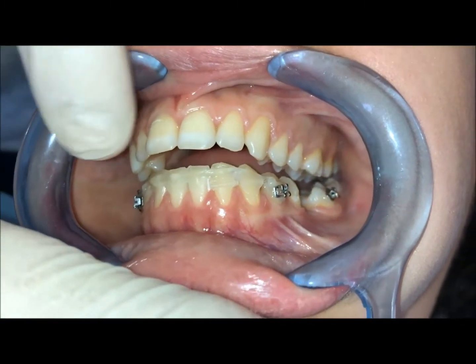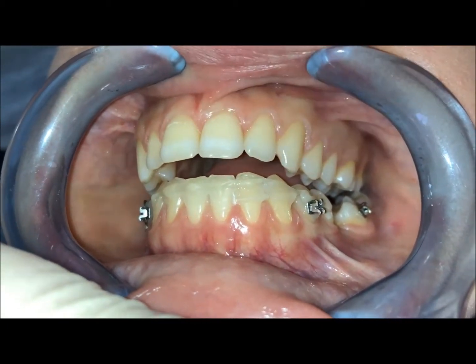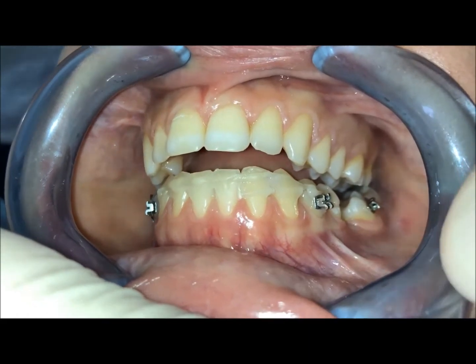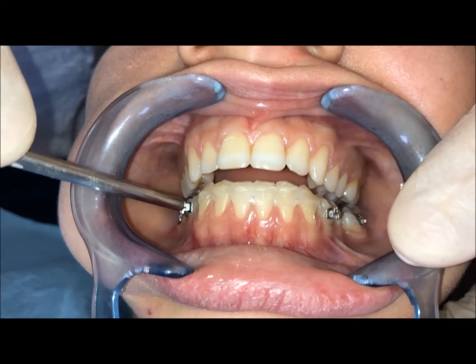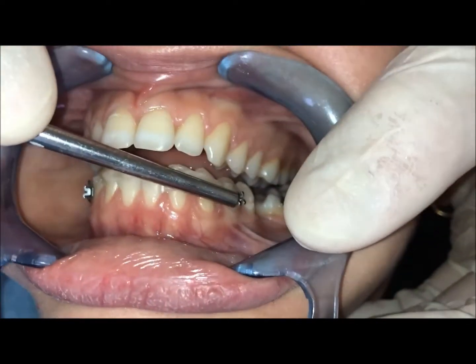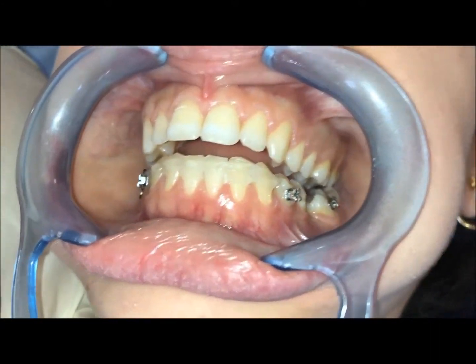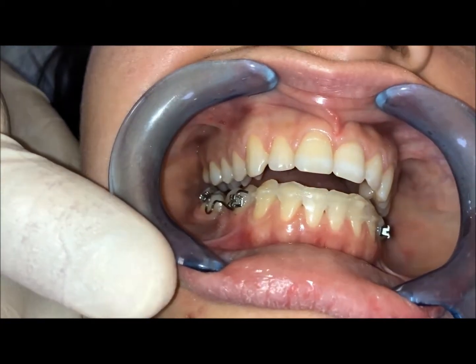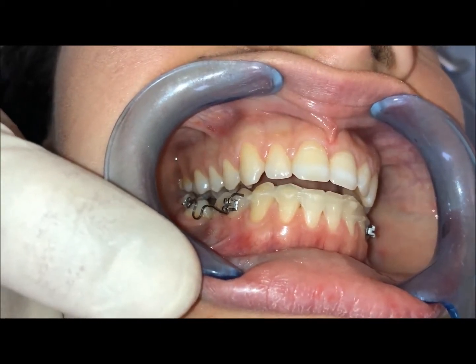We bonded just now a fiberglass very high, so in order to not create inflammation of the gingiva. Now we have to polish a little bit more the composite we used. We bonded only two brackets — on the first premolar here and first premolar here — with a fiber until the second premolar.